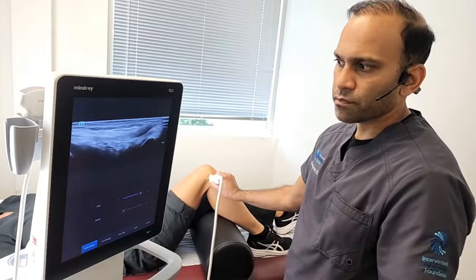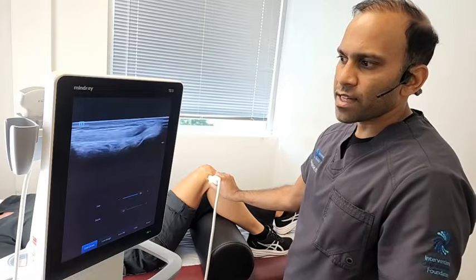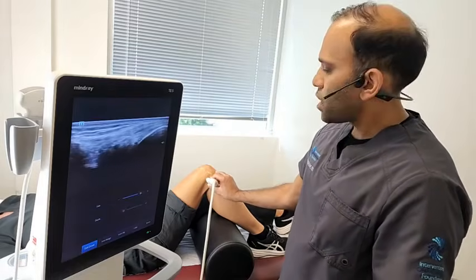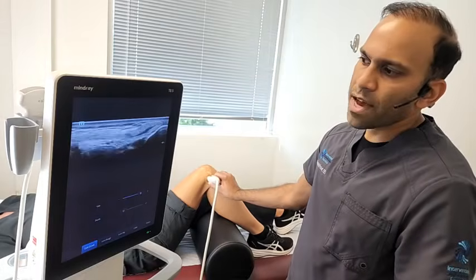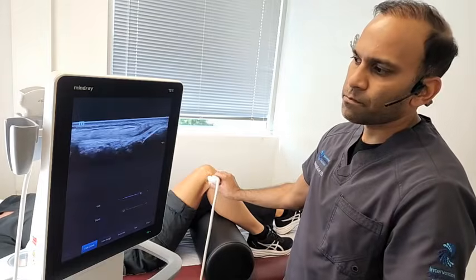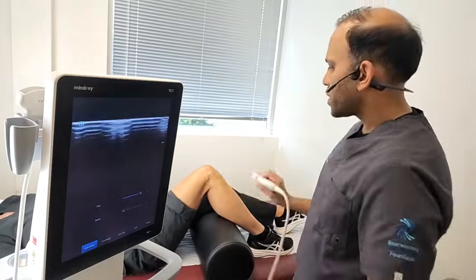here. Now, the other thing that attaches onto the fibula is the biceps tendon that comes from the thigh muscles over here. And here is an example of the biceps tendon now coming across here. Now, you could straighten out your knee.